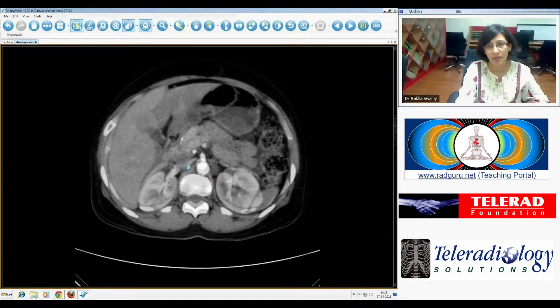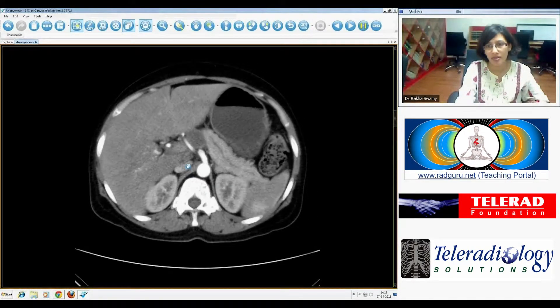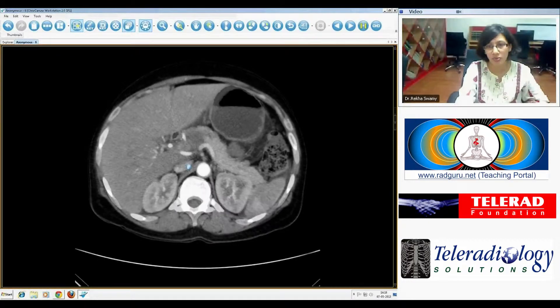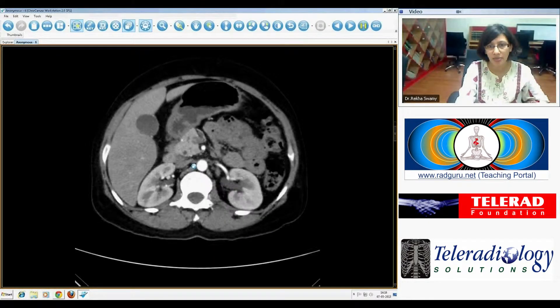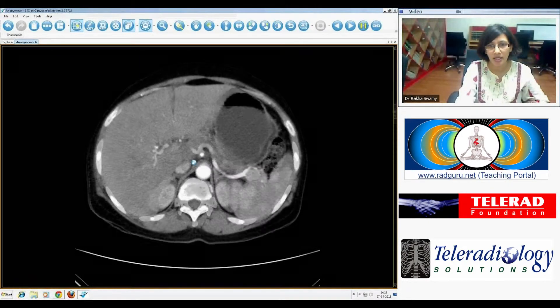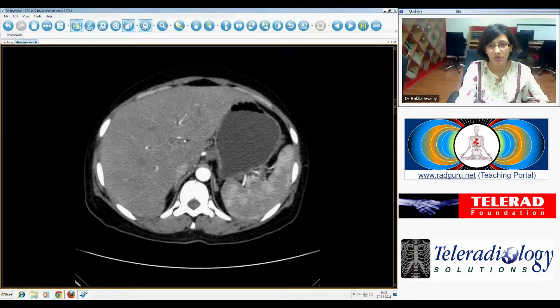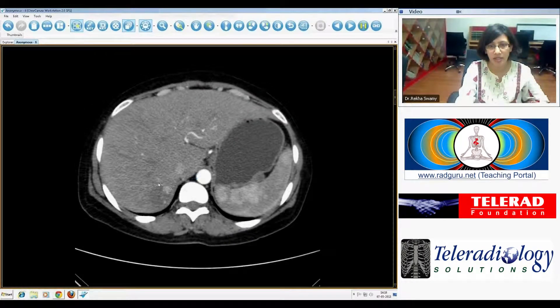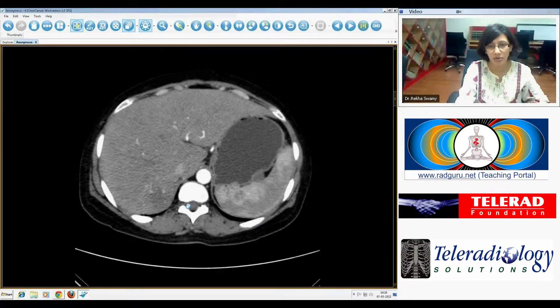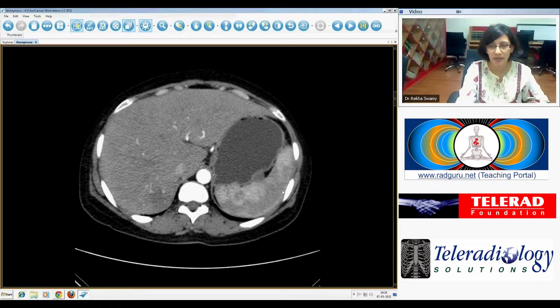The pancreas itself appears normal. The pancreatic duct is slightly prominent. The liver appears closely normal, apart from this low-density lesion within the right lobe with some peripheral nodular enhancement. We'll come back to that lesion a little bit later.